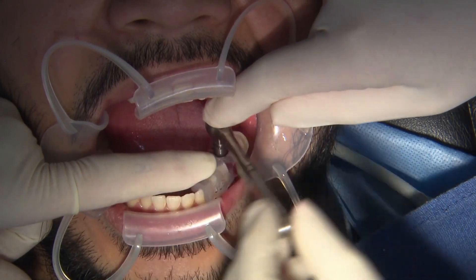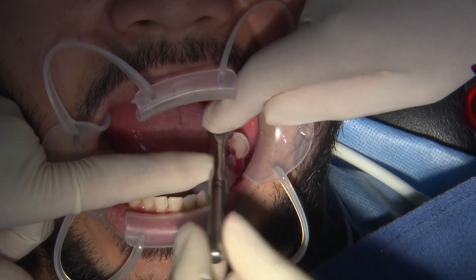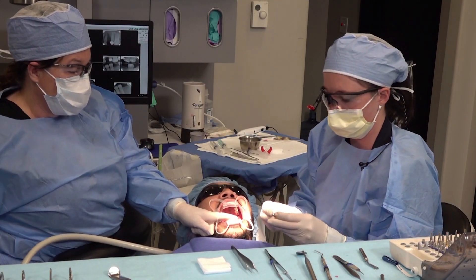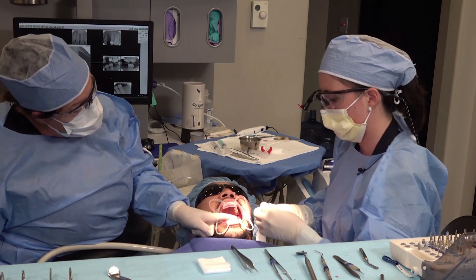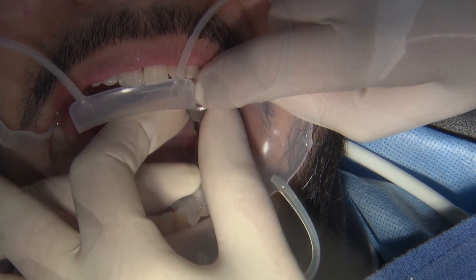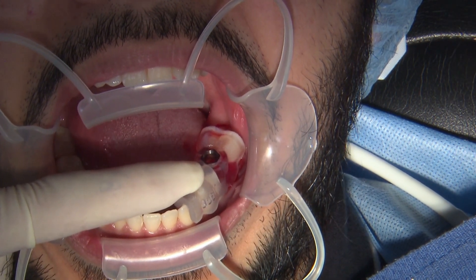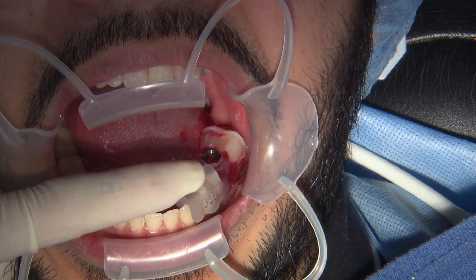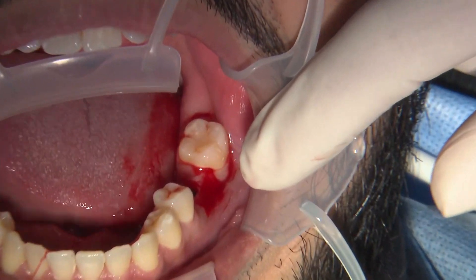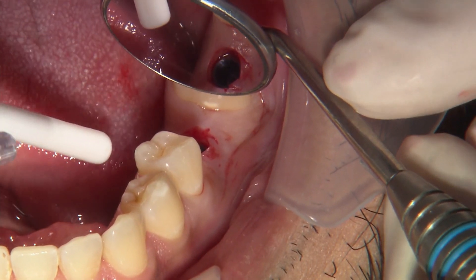I do like to apply a little downward pressure as I'm inserting the implant. This will help the implant, especially in softer bone, from stripping out. Then you take your driver and disconnect the mount and pull the mount right out. We can take our guide off, and you can see our implant is right where we wanted it to be.